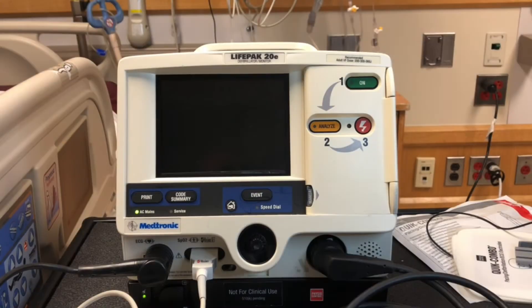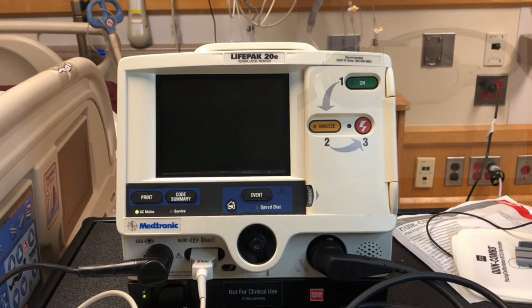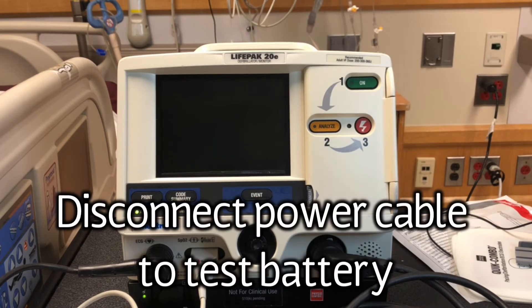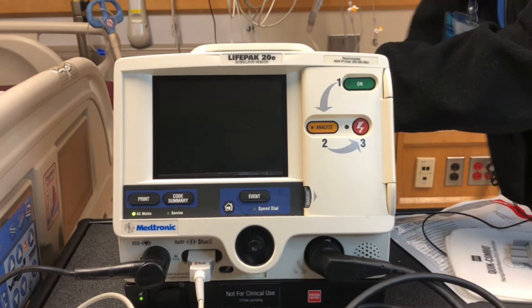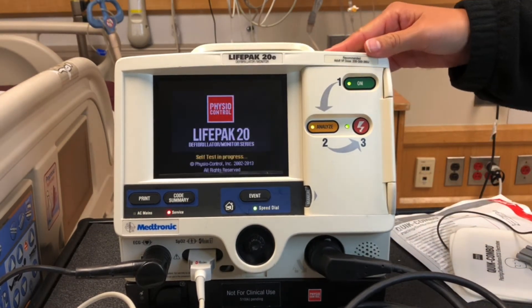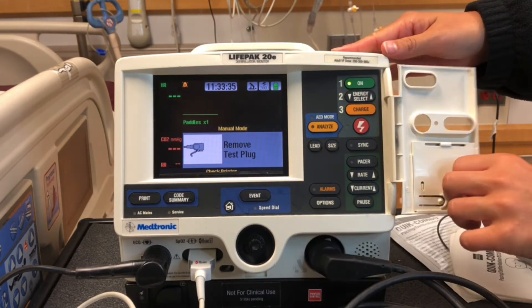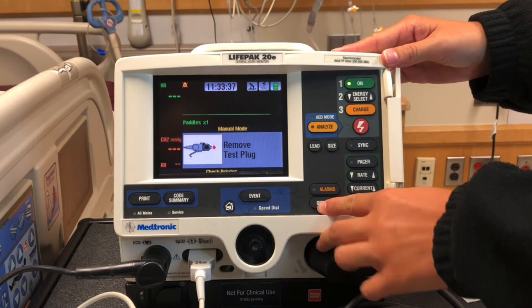Let's demonstrate a user test. Ensure the therapy cable is connected to the test plug. To test the battery, disconnect it from power, turn the LifePak on, push analyze, open the door, and remove the test plug.